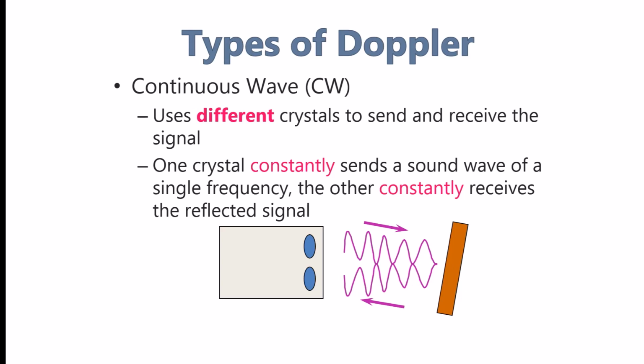The advantage of continuous wave Doppler is that it can accurately display flow of any velocity without distortion. The disadvantage is that it samples everything along the Doppler line, and you cannot position the Doppler to listen at a specific area along the path.